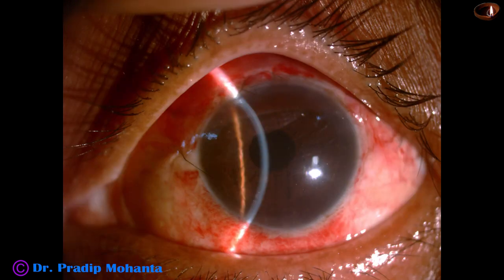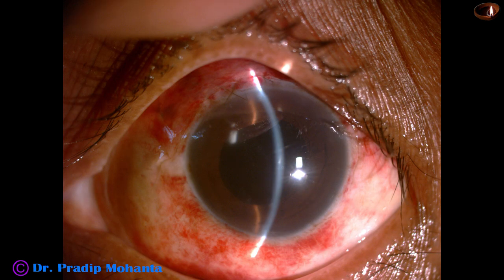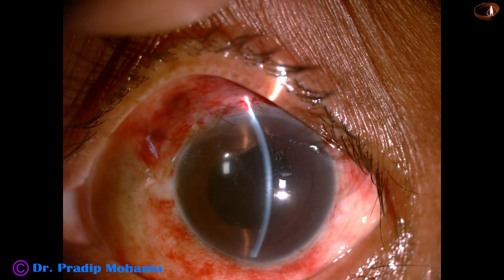These are some postoperative pictures. The pupil is round, the cornea is quite clear, and there are a few Descemet's membrane folds. These pictures are 48 hours after surgery. I dilated the pupil to see the retina and examined the retinal periphery — it is okay. There is no retinal tear anywhere in the periphery. I will repeat indirect ophthalmoscopy after 7 days.